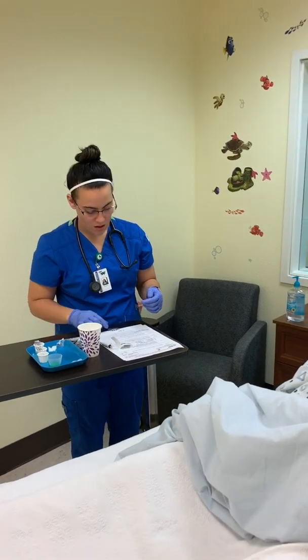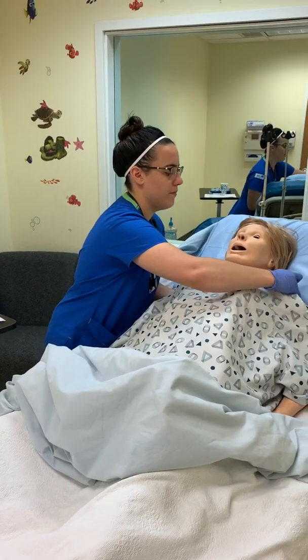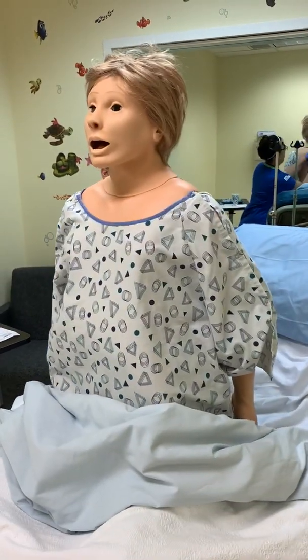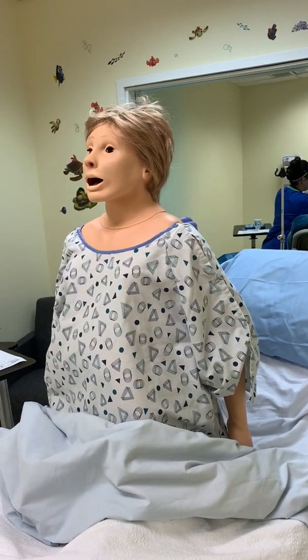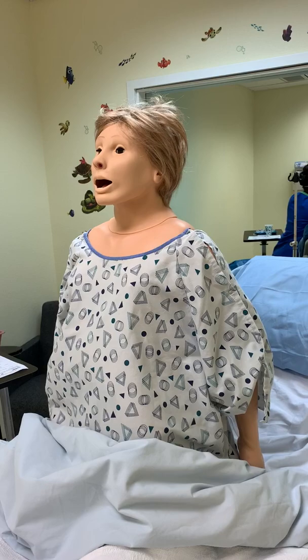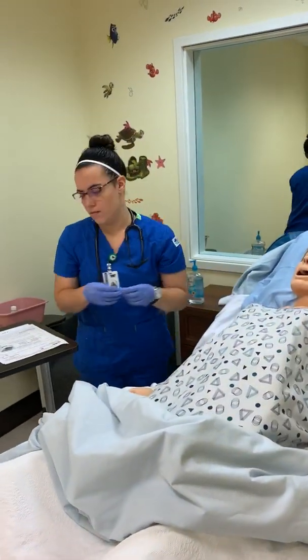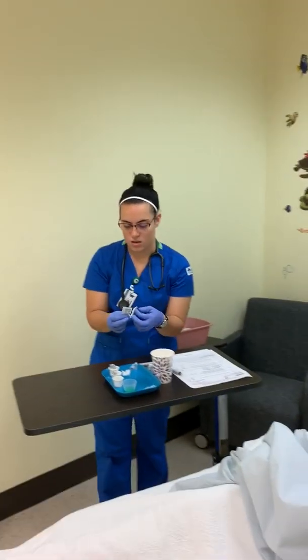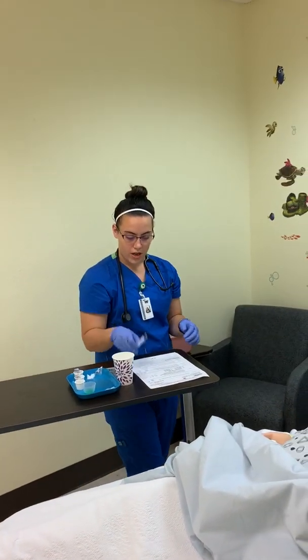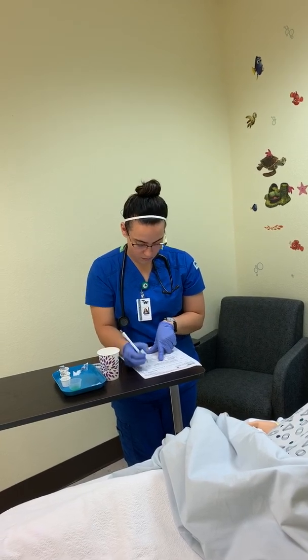Okay. These patches usually stick to you all right? Okay, perfect. So I'm just going to lean you up. I'm going to put it on the left side this time, okay? Perfect. And back. Okay, and I changed my gloves again. And then the last thing is administer the patient's medication. Check off on the patch. Okay. Put it in the left upper, that way the nurse knows.